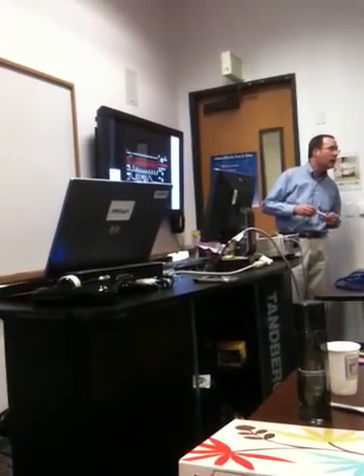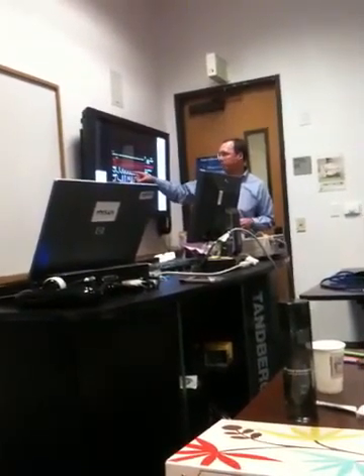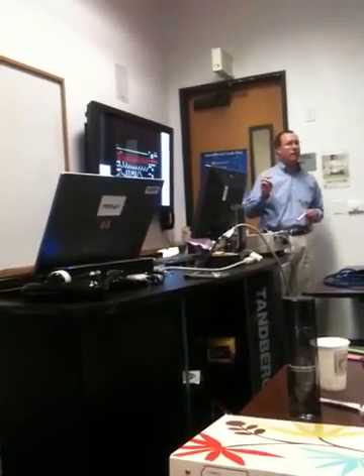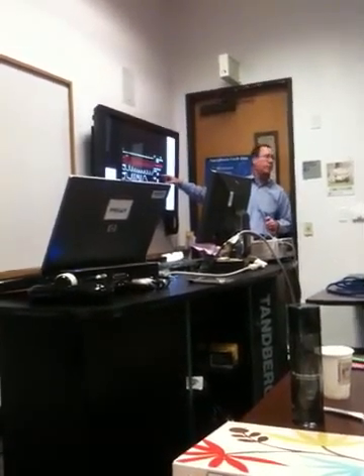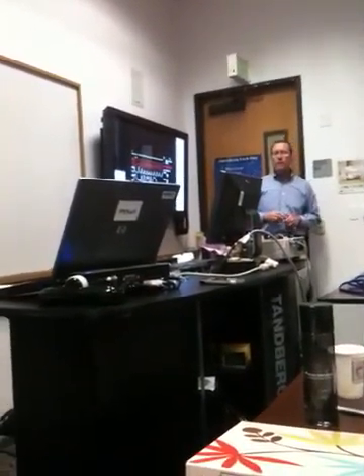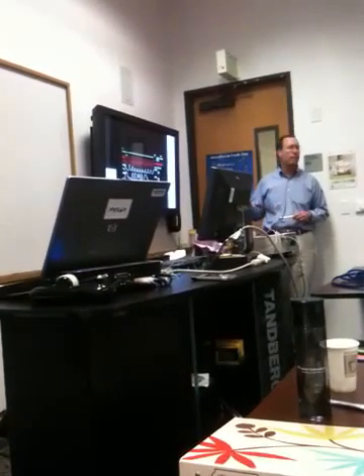Pardon me? No. This is your pulse oximeter. Yeah, it's actually showing the pulse from the pulse ox, and their saturation is 98%, so that's a good saturation. Now, one of the reasons they do that is sometimes you can tell a pulse just from that.